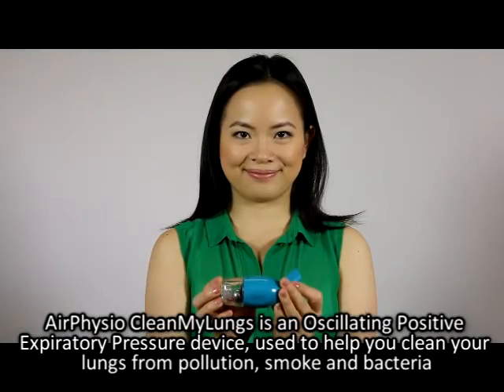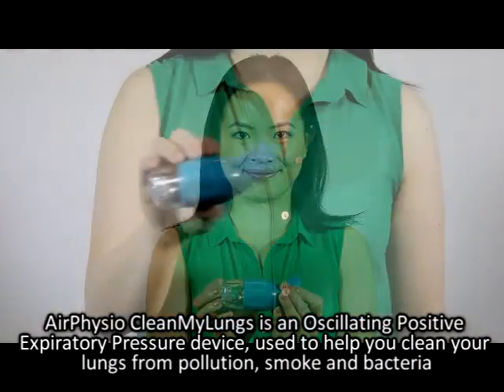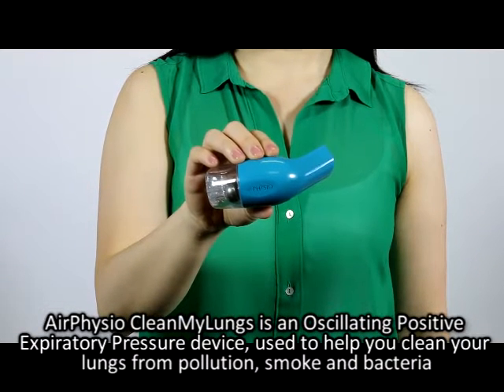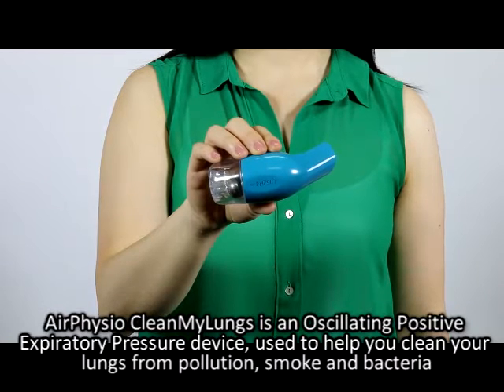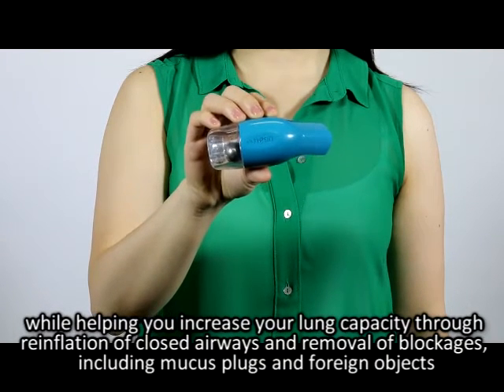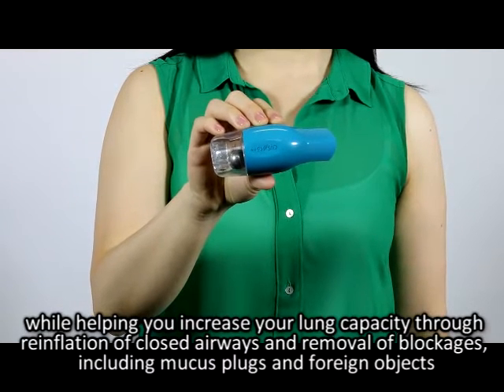Air Physio Clean My Lungs is an oscillating positive expiratory pressure device used to help you clean your lungs from pollution, smoke, and bacteria, while helping you increase your lung capacity through reinflation of closed airways and removal of blockages.